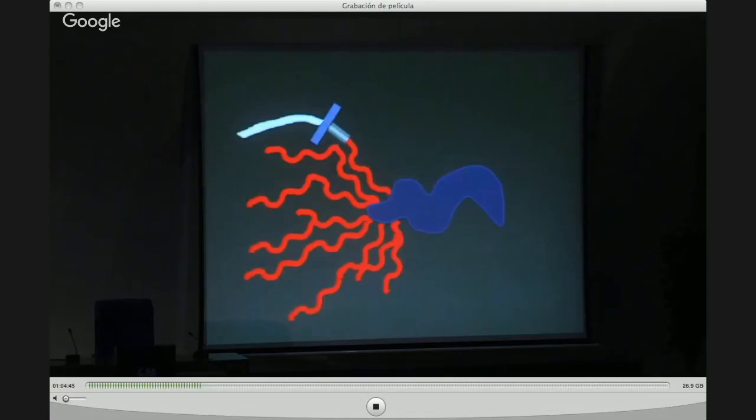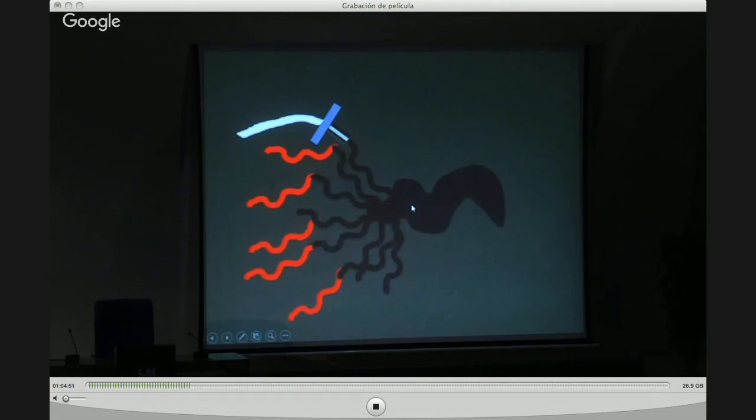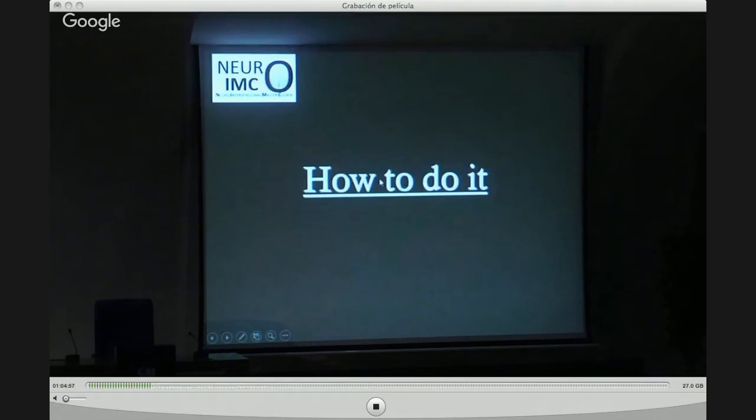From this channel, we can puncture through the hole and start injecting, reflux, and then continue occluding the vein and retrograde the other feeders. So the thing is how to do it. I'm going to show you the materials, and we know the cases. All the 5 cases were similar, so I'm going to select 2 illustrative cases to show you.